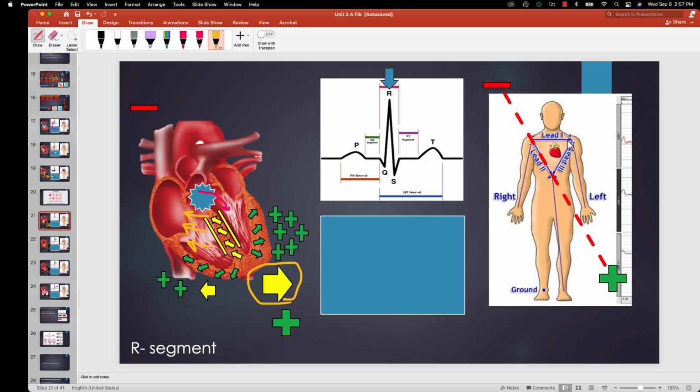All right. So now, how does the machine then determine which way to make a deflection? It's going to identify that the ventricles are producing the largest signal for deflection. And of course, as we all know, the left ventricles are going to push out all of that blood into the rest of the physiology, right? So what's going to happen here is we are going to get a massive surge, which is your R wave, right?